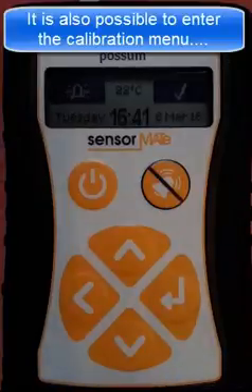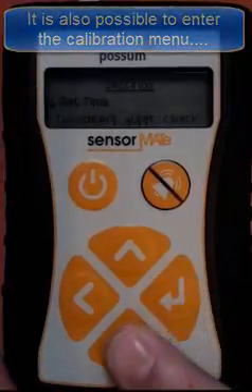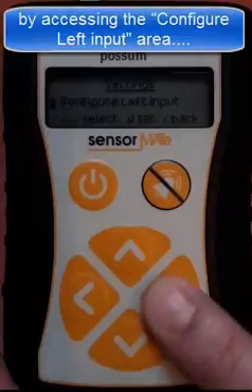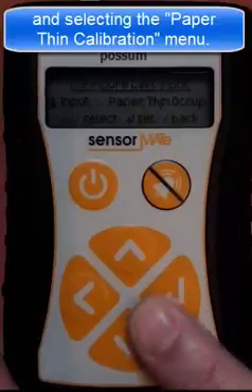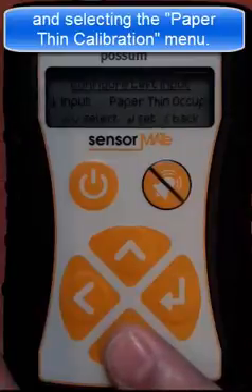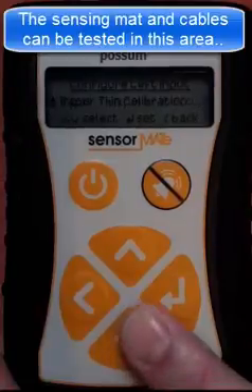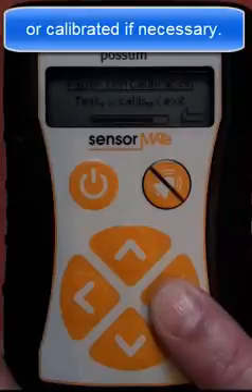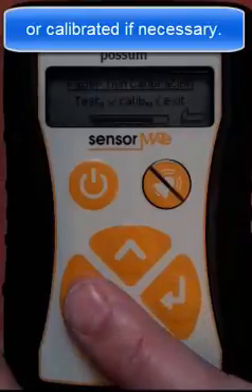It is also possible to enter the calibration menu from the configure left input area in the system settings menus. After selecting the paper thin calibration menu, the installer can check the calibration and ensure that the cables and mat are working correctly. Re-calibration is also possible from this menu.